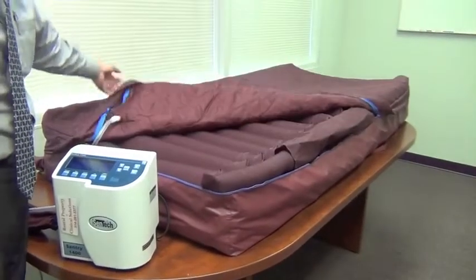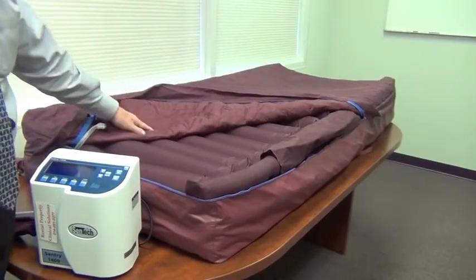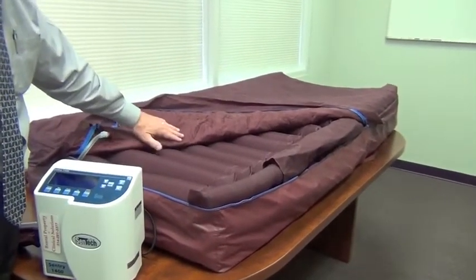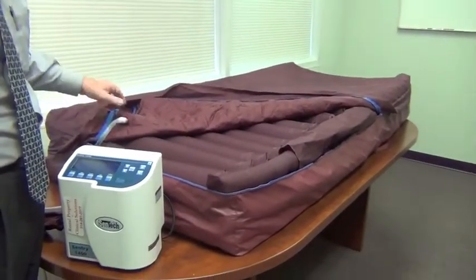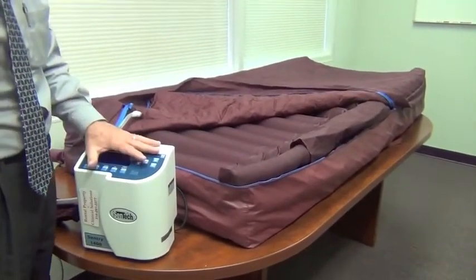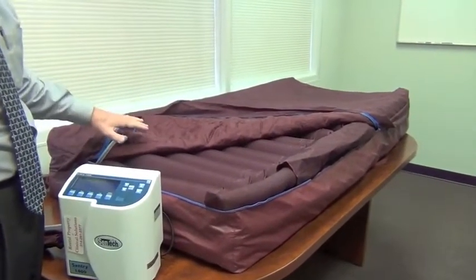I wanted to pull this back and show you inside here. The backing of the cover is a quilted Dacron material, so the moisture vapor coming through here accumulates in the Dacron fill and is evaporated by the airflow, which again is a dedicated air supply inside of this unit, which provides the flow of air into the coverlet.